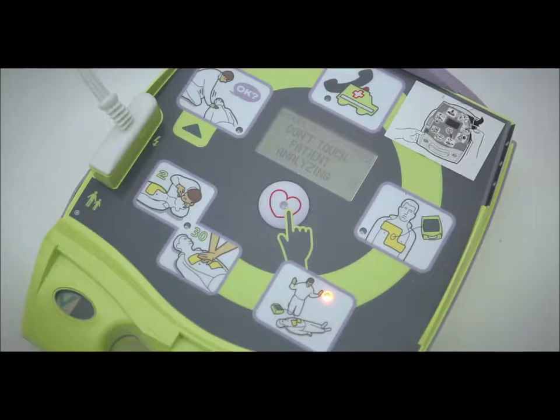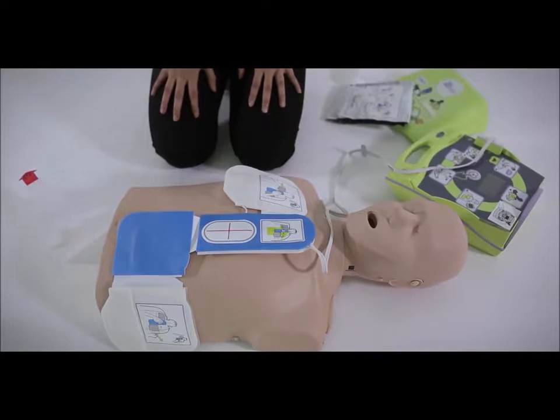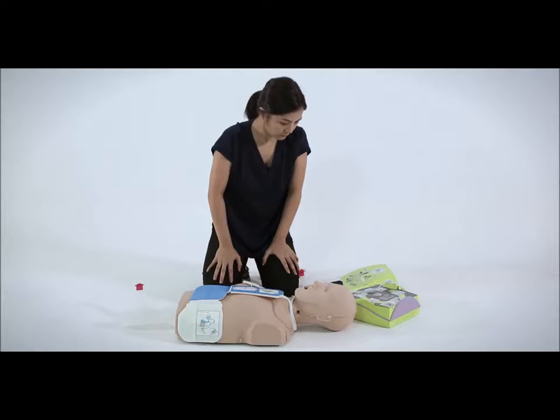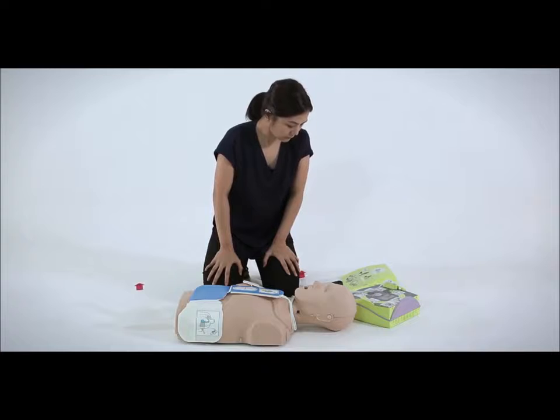Don't touch patient — analyzing. Press flashing shock button. The AED will determine whether the victim can be treated using defibrillation. If this is possible, the AED will announce: Shock advised. It will then remind you: Don't touch patient — analyzing. Press flashing shock button. Maintain a safe distance from the victim and make sure that no one is touching the victim before pressing the shock button.